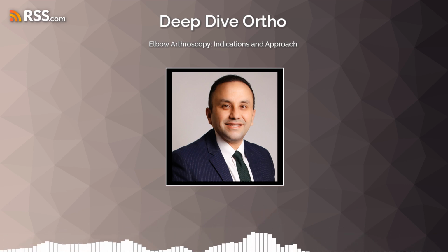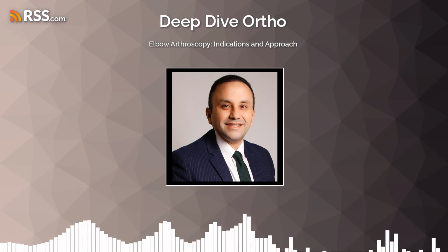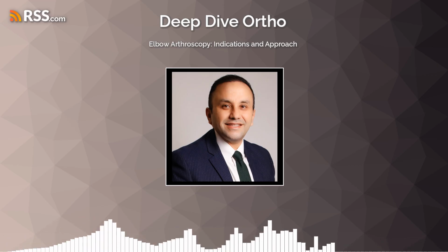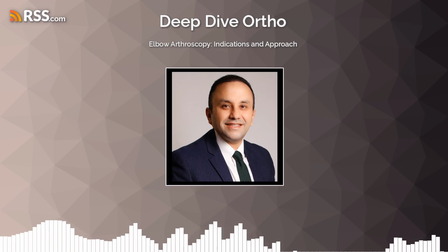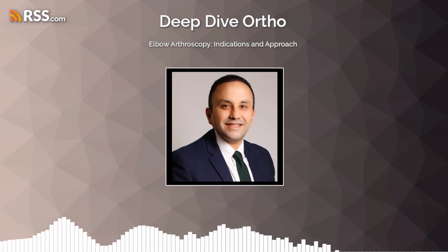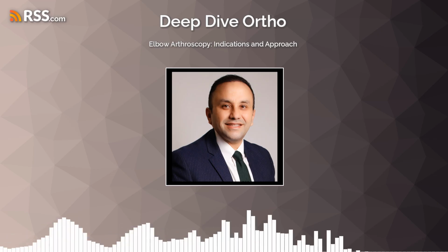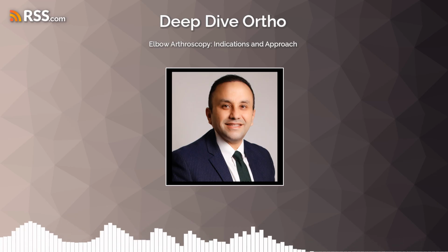Arthroscopy's role is crucial, especially for indirect assessment, as only portions of the UCL can be directly visualized during the procedure, specifically 20–30% of the AOL and 30–50% of the POL. Studies by Timmerman and Andrews demonstrated that an intact AOL results in less than 1 millimeter of ulnohumeral joint opening with valgus stress, elbow at 70 degrees, whereas a complete AOL sectioning leads to 3-5 millimeter opening.